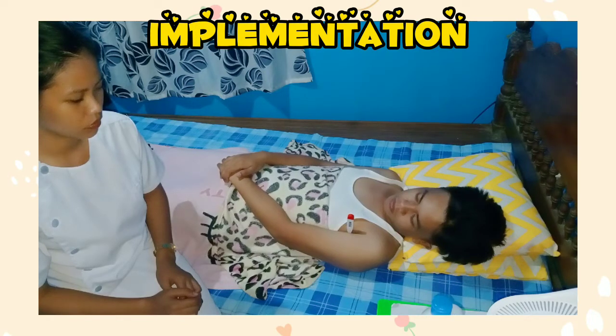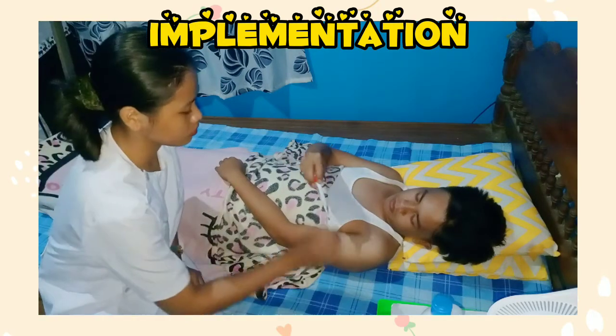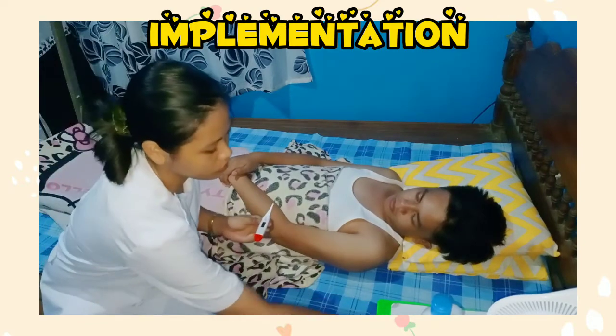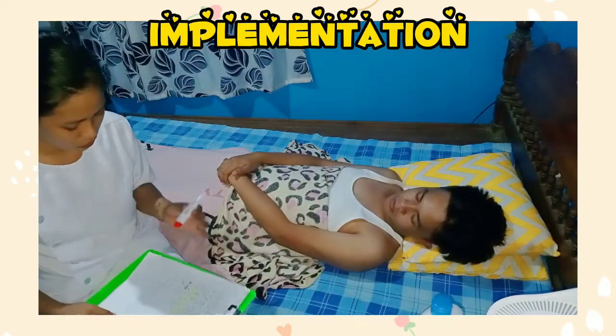Wait the appropriate amount of time. When the electronic and tympanic thermometer will indicate that the reading is complete through the light or tone. After that, remove the thermometer and discard the cover or wipe with a tissue if necessary. Then document or read the temperature.